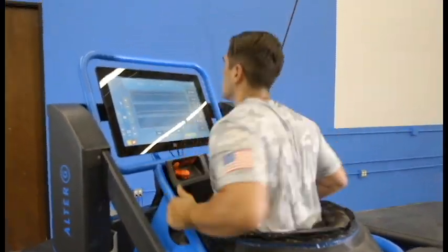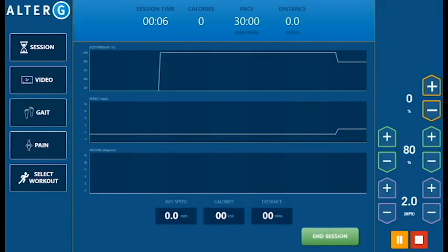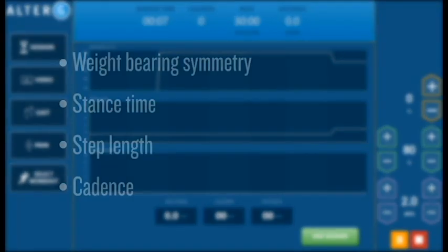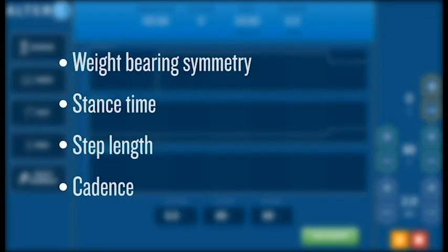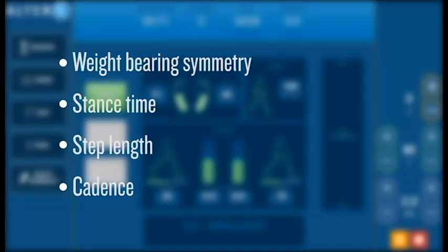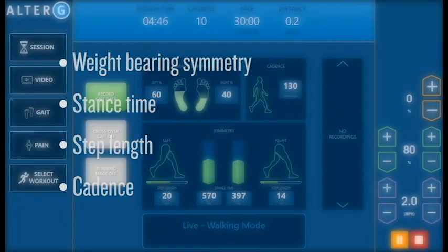Integrated gait analytics will help you identify gait deficiencies in your patients that you might not be able to see otherwise. Measure and record weight-bearing symmetry, stance-time symmetry, step-link symmetry, and cadence.